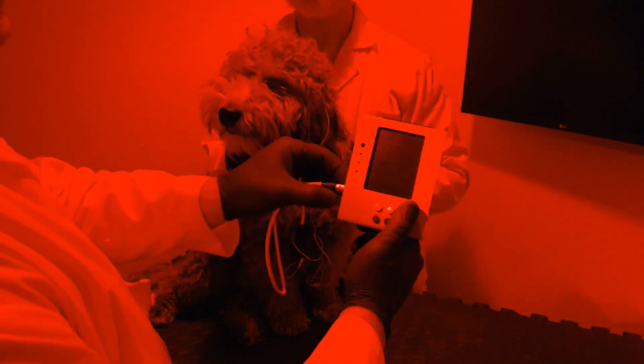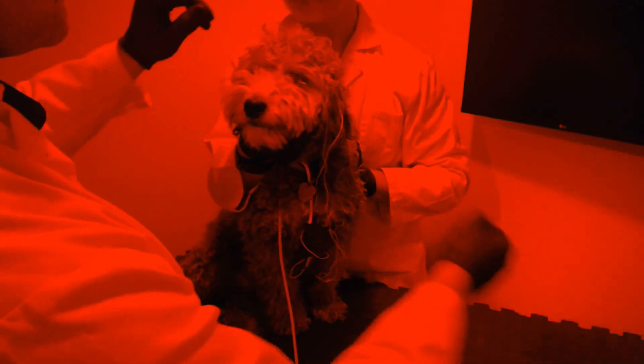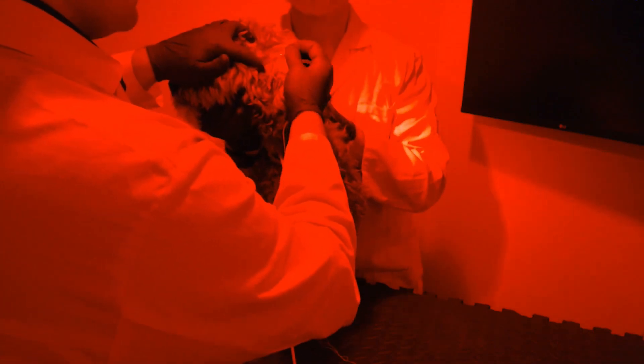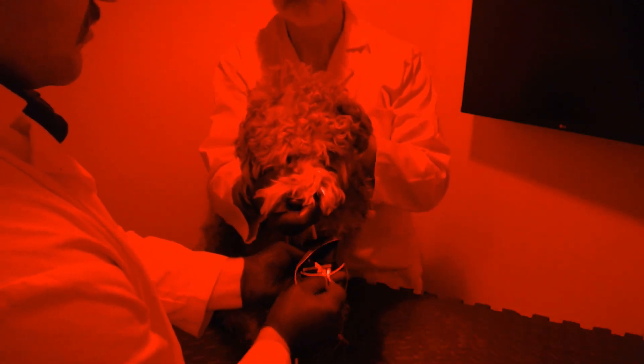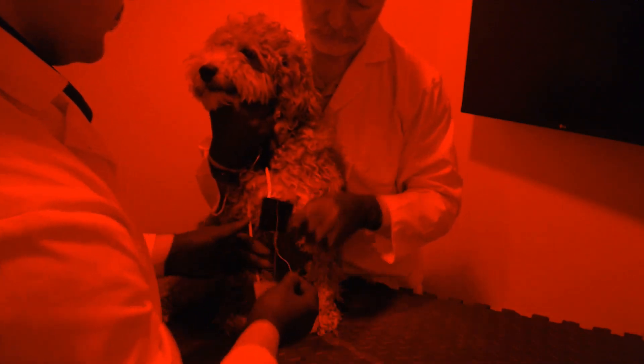Now that the test is over and we have turned off the unit, we can disconnect the pod by pulling out on it and set it to the side. We will now start removing electrodes, starting with the eye electrode, setting that off to the side. Next will be the reference electrode — we will unplug that from the pod since it has a sharp on it and set it well off to the side. And lastly will be the ground — pull that one out, unplug it from the pod as well, and set that one way off to the side. We can now remove the pod from the dog's collar.